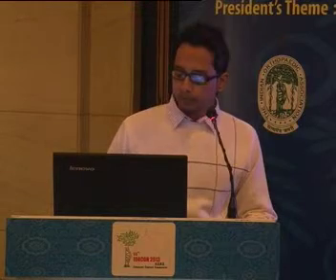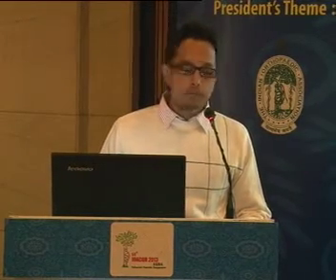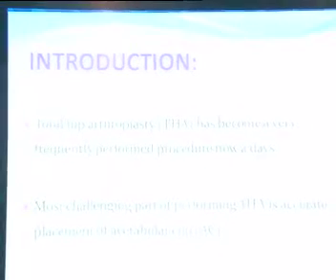Today, I am going to present upon acetabular cup placement in total hip arthroplasty: how to be accurate. Total hip arthroplasty has become a very frequently performed procedure nowadays, and the most challenging part of performing it is accurate placement of the acetabular cup. Acetabular cup malpositioning is a prime cause of dislocation after total hip arthroplasty.